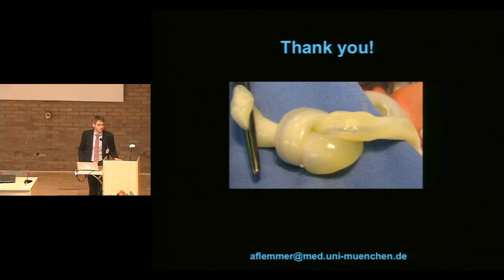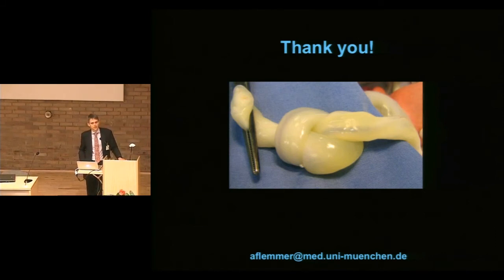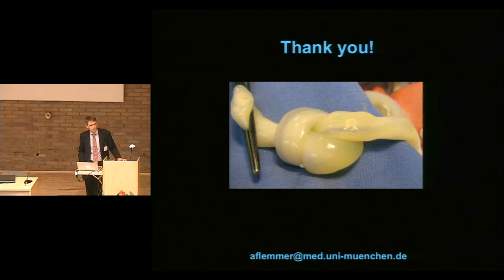This is experience. Other questions? Can we use the umbilical artery line for other purposes than just for monitoring? It has been used also for infusion therapy. If you are not able to get venous access at some points, people even used it for exchange transfusion. But I'd be very careful to suggest that. Antibiotics and some drugs, medicines? I have no suggestions in that. It might be a possibility, but you have to take into consideration that a lot of drugs are hyperosmotic and might induce arterial spasm. So I'd be very careful.